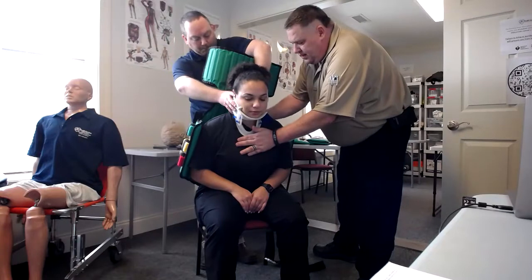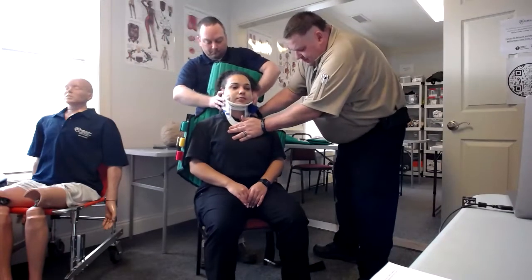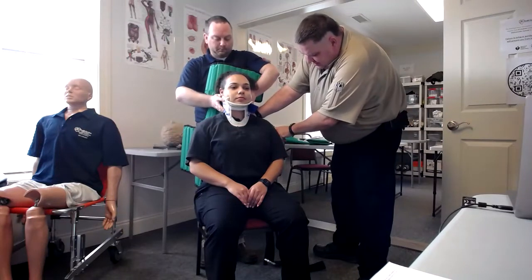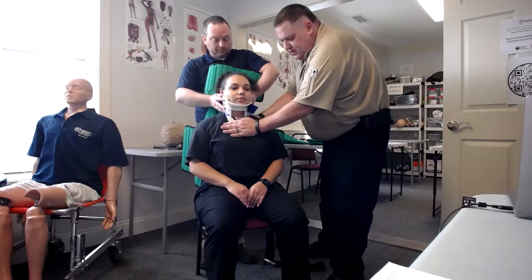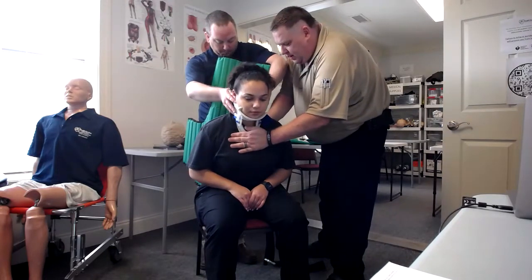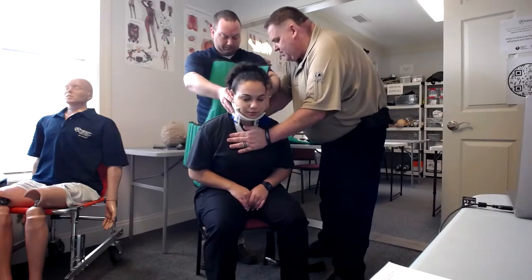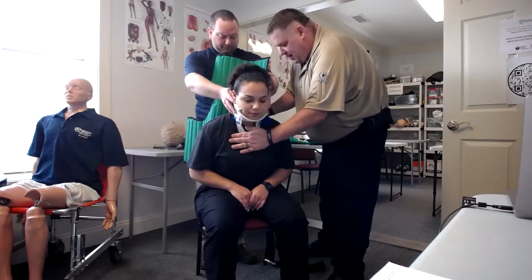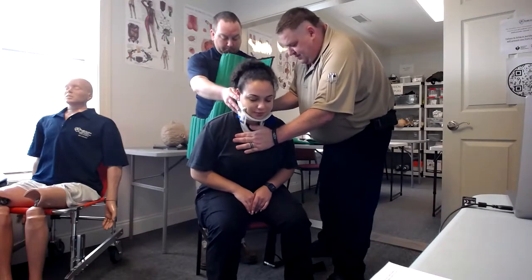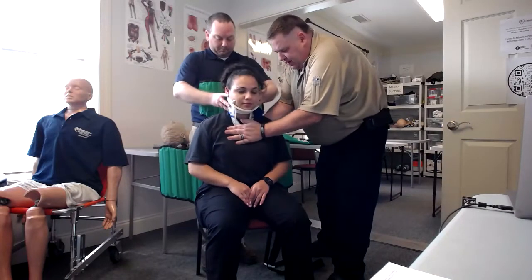We're then going to move the patient back. This is not entirely in proper position — as you can see, these wings should be going under the arm. So what we're going to do is, again maintaining C-spine control, move her forward a little bit further and wiggle this down. We're going to have you sit a little bit forward here, get that slid back in there, and then bring her back.